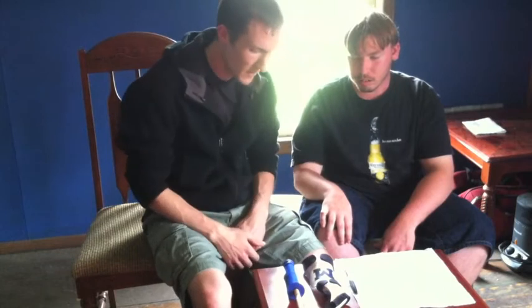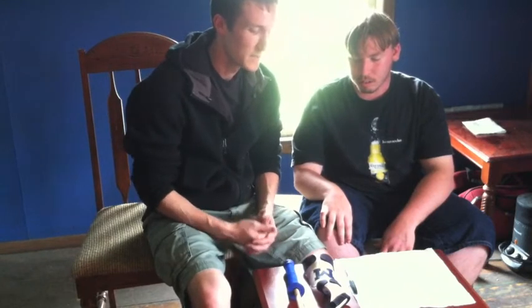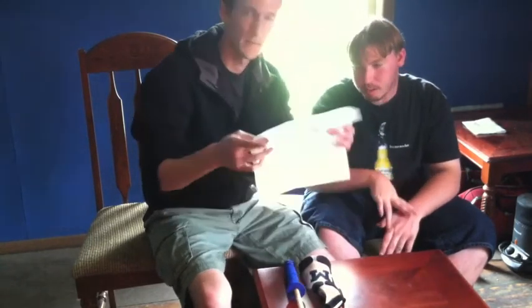So with that being said, the very first thing that we want to do when we create a splint is take measurements. Okay, and we do that using paper towel. Here, just one second, Nick.